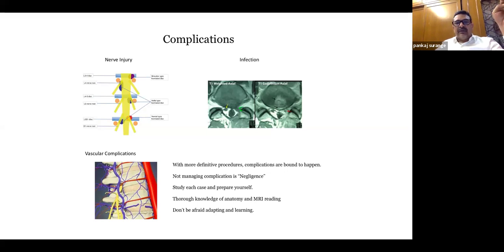But most of the time, whatever dural leak is there is very small. Even a dural leak that happens intraoperatively, with the irrigation fluid we are giving, is very difficult to identify. Mostly we detect them postoperatively, when the CSF starts collecting and coming from the puncture site. So it is not possible to repair them intraoperatively. In those cases, we have to go open and suture this dural tear.